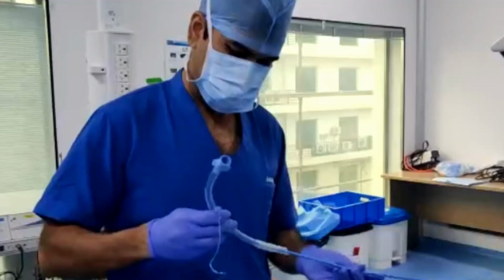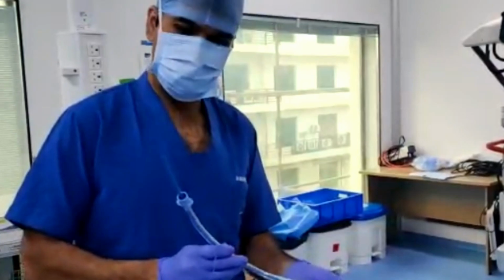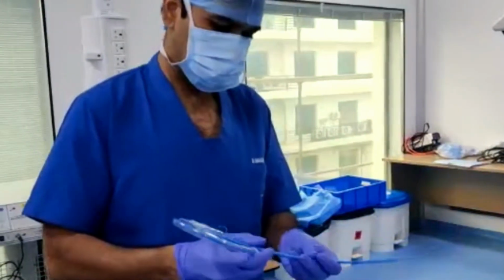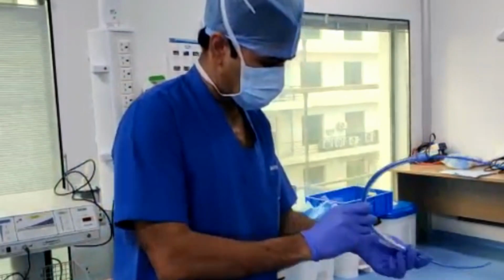Another important technique tip is that you can preload the tube beforehand. If you are intubating alone and you don't have assistance, you can preload the tube like how it is shown, and then there is something called a kiwi grip. This is called the kiwi grip, and then you can just send the bougie first. On top of that, the threading becomes very easy in this technique.